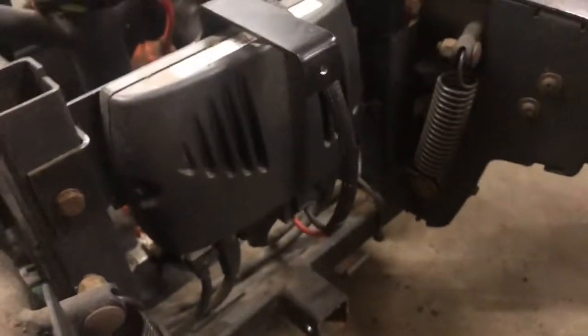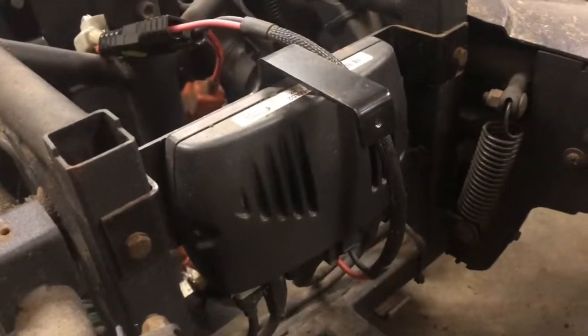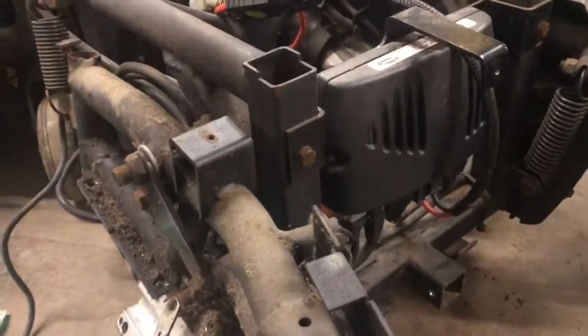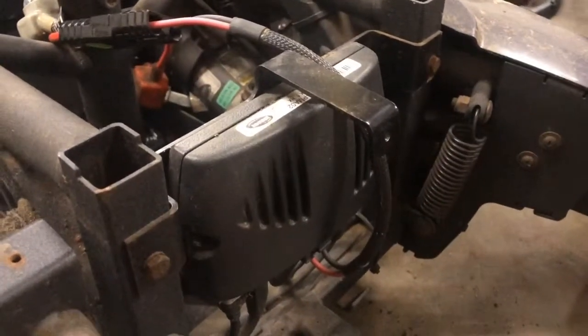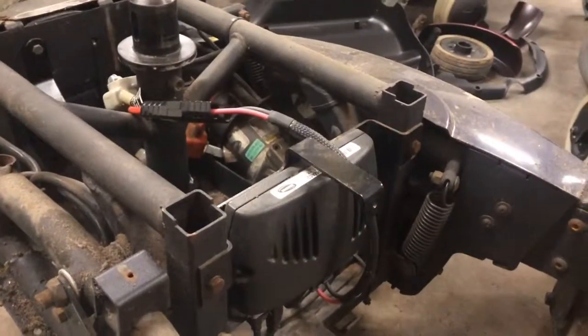So you can actually follow if you're just doing one motor. This is what I was saying earlier. If you buy a set of motors off eBay, don't do any of this until you first hook it to your box. Make sure the motors are locked, because if they're unlocked, they're going to throw a flash code. Go ahead and hook your motors to this box, and don't even bother taking anything apart, because if the motors aren't the problem, or you got a faulty motor, you got a heck of a lot of stuff laying everywhere.